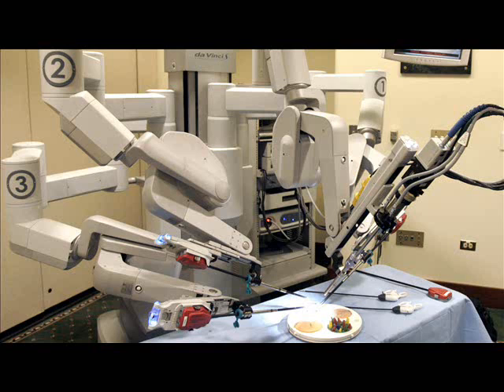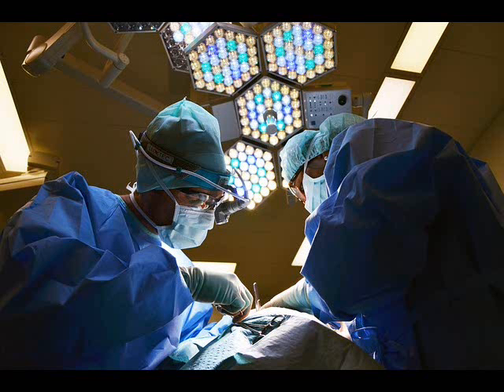In April 2008, the same team of surgeons performed the world's first fully minimally invasive liver resection for living donor transplantation, removing 60% of the patient's liver, yet allowing him to leave the hospital just a couple of days after the procedure, in very good condition. Furthermore, the patient can also leave with less pain than a usual surgery due to the 4 puncture holes and not a scar by a surgeon.